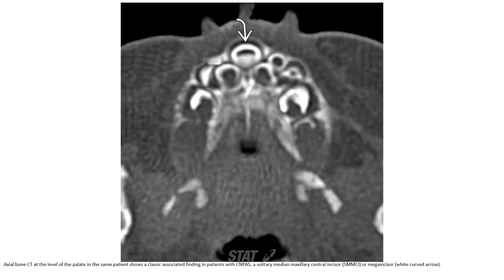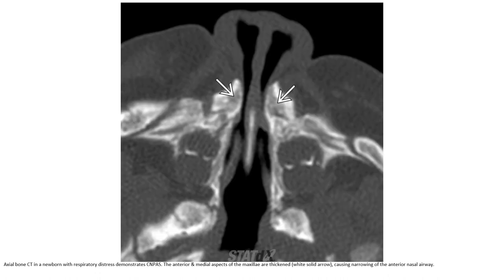Axial bone CT at the level of the palate in the same patient shows a classic associated finding in patients with congenital nasal pyriform aperture stenosis: a solitary median maxillary central incisor, also known as a mega incisor.